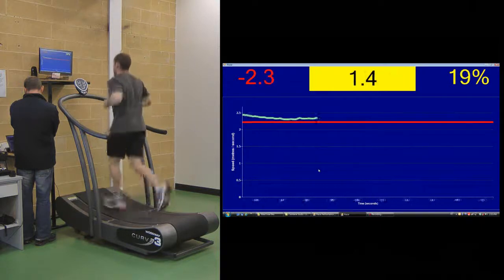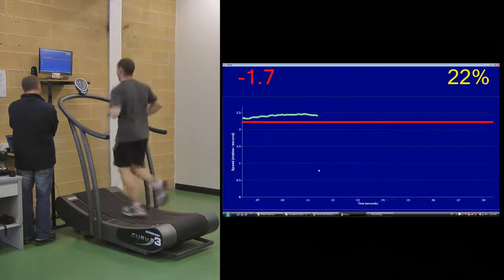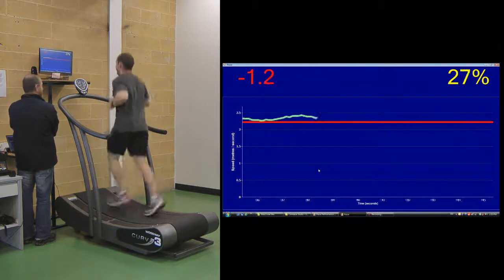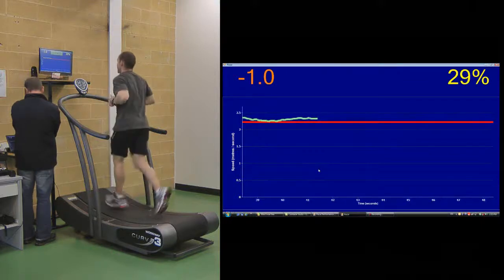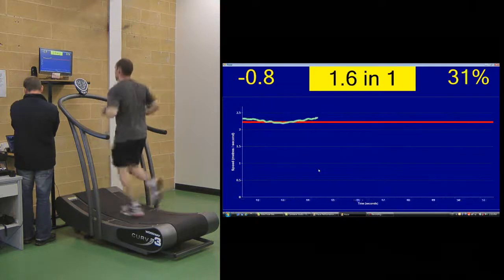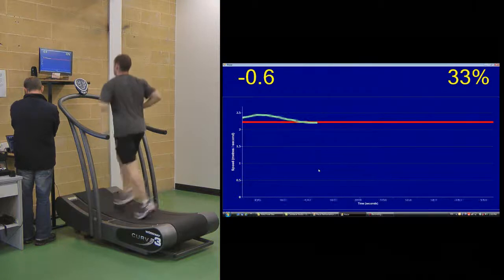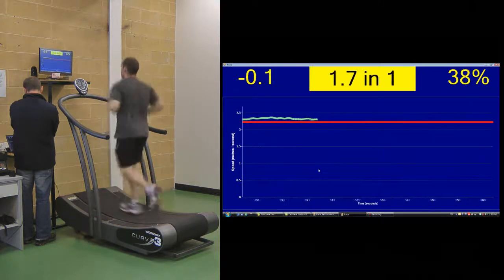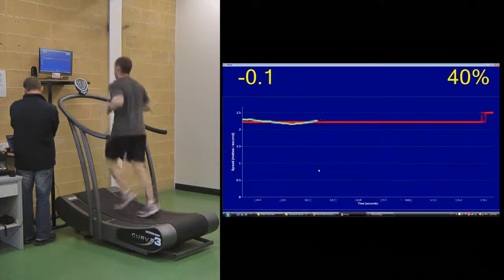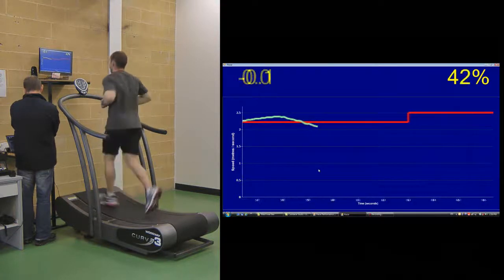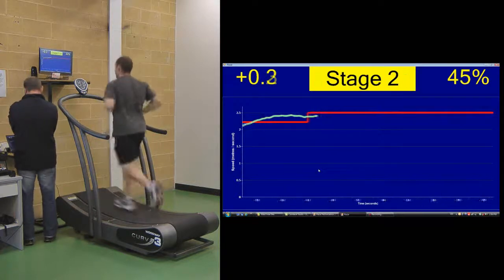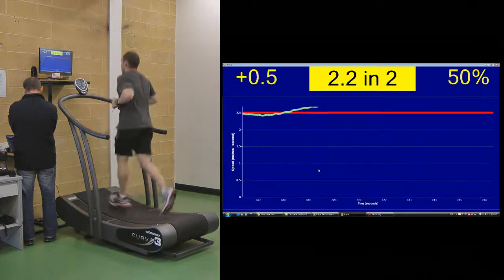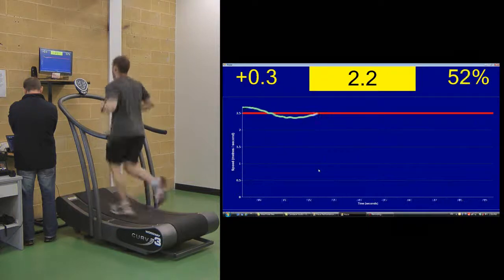You can see the individual stages coming up, the same as you would have in a normal beep test. The program moves into Stage 2 with the beep.